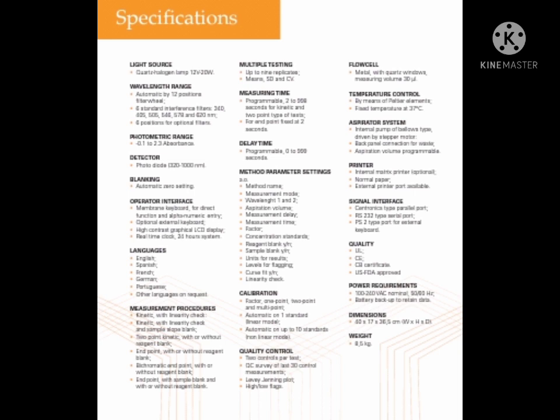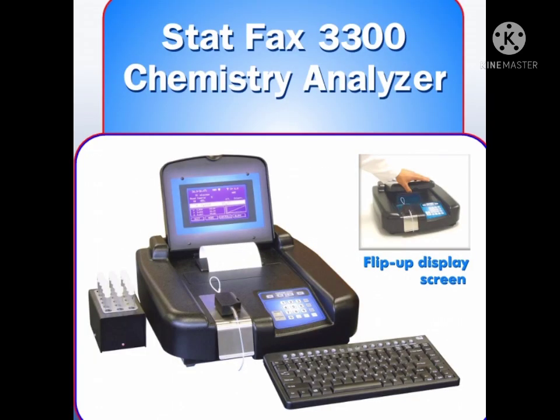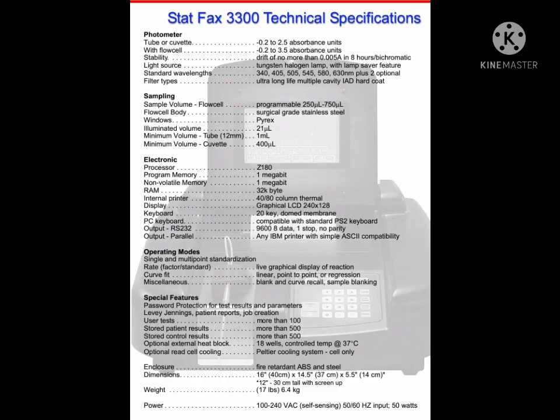So its flow cell volume is around 30 microliter. In the Indian market you can see many installations of these instruments. STATFAX 3300 is a semi-automatic clinical chemistry analyzer by Awareness Technology Inc.